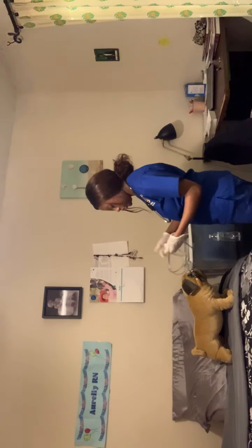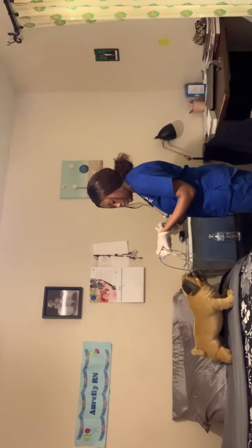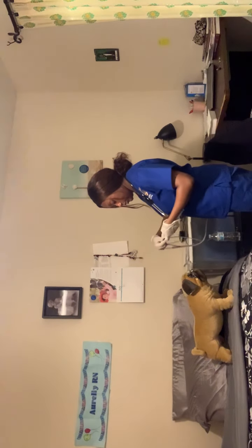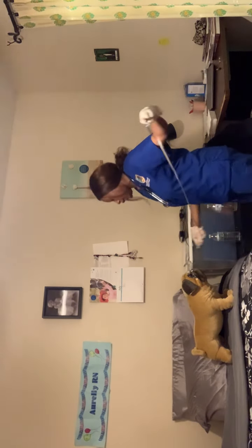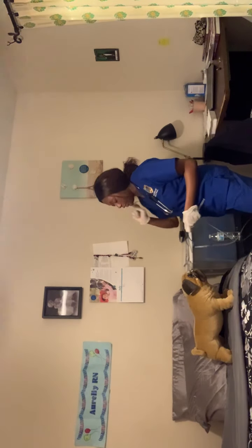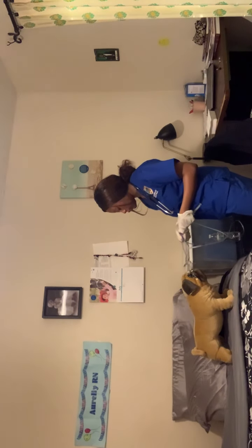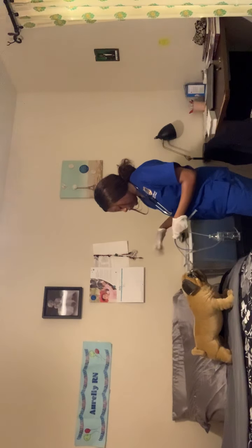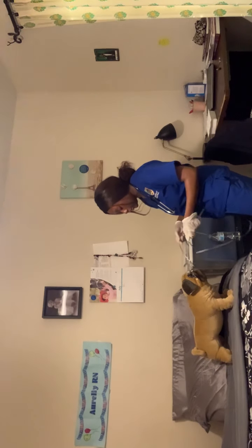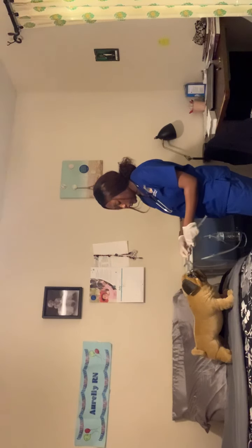And I would attach my syringe to the NG tube. It won't fit, but that's okay. And so now I would go ahead and tell her, all right, Miss Dog, I'm gonna insert it now, and you're gonna feel some discomfort, and I would like you to swallow, and I will be moving it along as you swallow, okay? So I will move it down and backward, steadily, holding on to it the whole time.